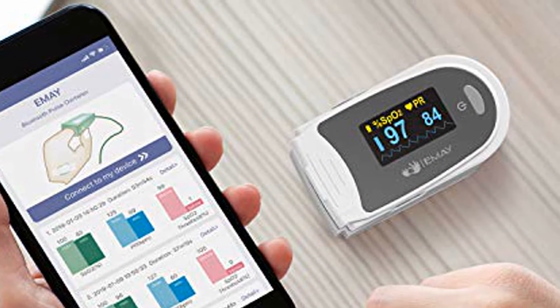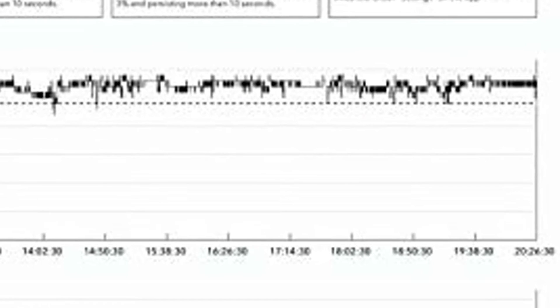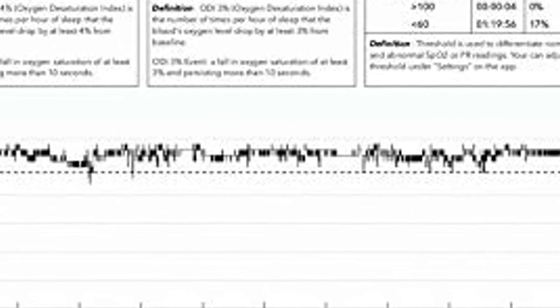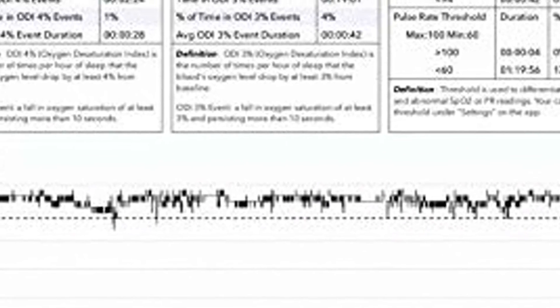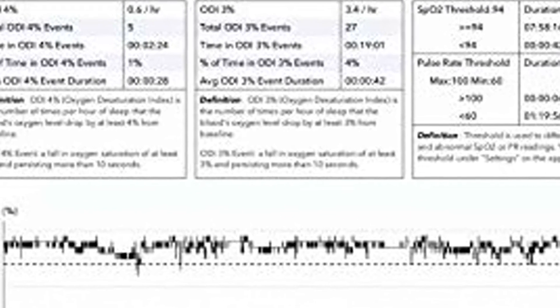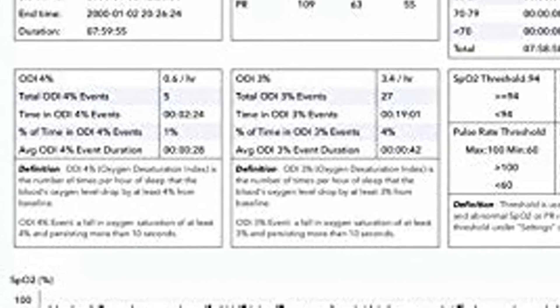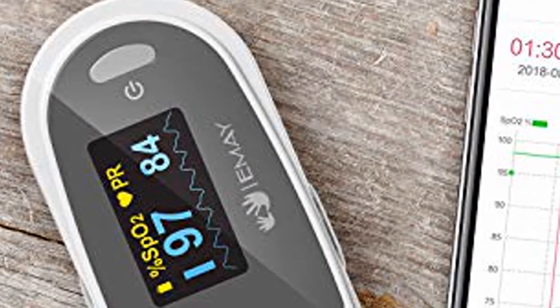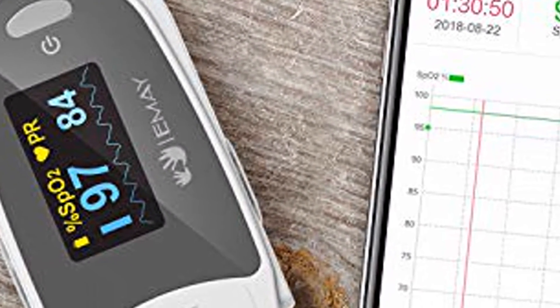Free iOS and Android app: (1) Review historical and granular data second by second. (2) Sleep report with detailed analysis and trends of your overnight blood oxygen and heart rate. (3) Export CSV file of data for further analysis or sharing.